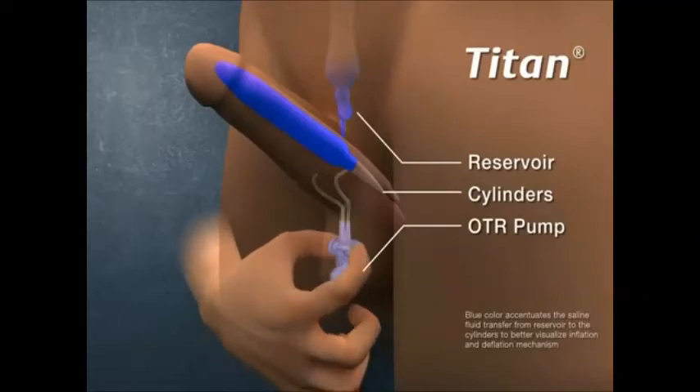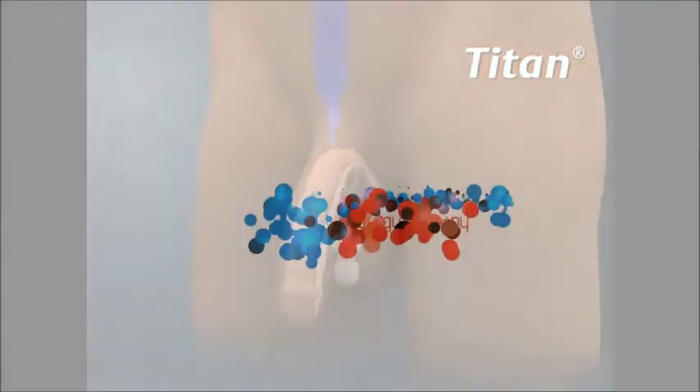To return to a flaccid state, fluid pressure in the cylinders is released when the patient momentarily depresses the deflate valve button, enabling fluid to return to the reservoir, thus returning the penis to the flaccid state.